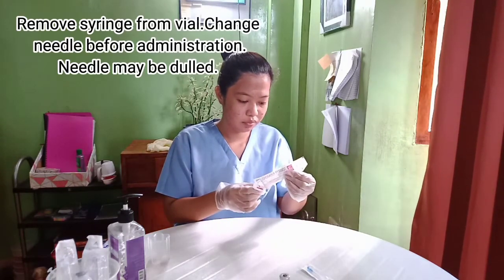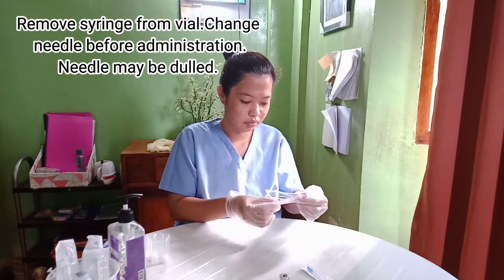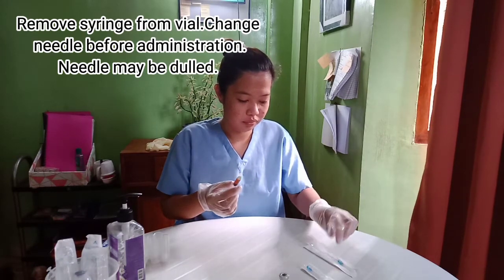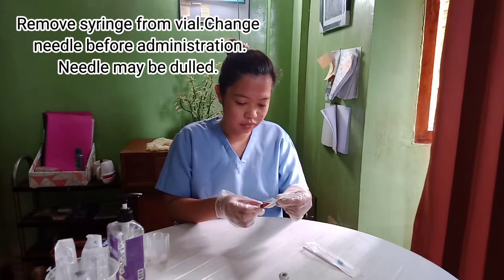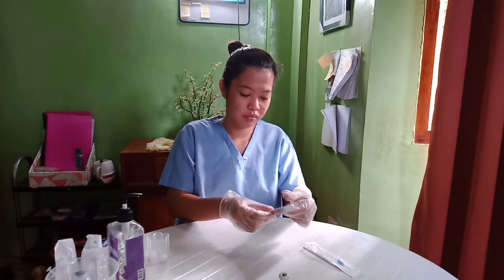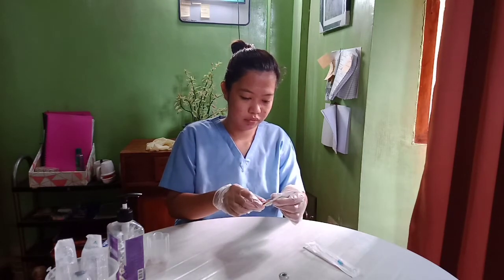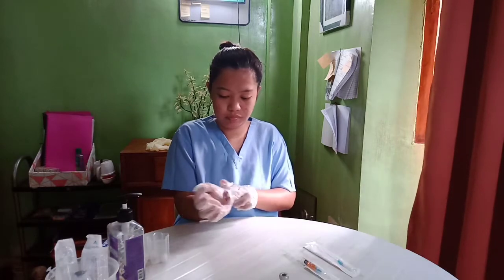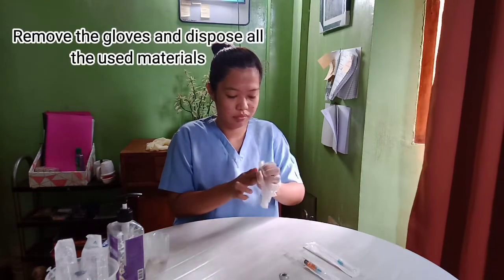Remove the syringe from the vial and change the needle before administration, as the needle may be dull after use. Remove the gloves and dispose of all used materials.